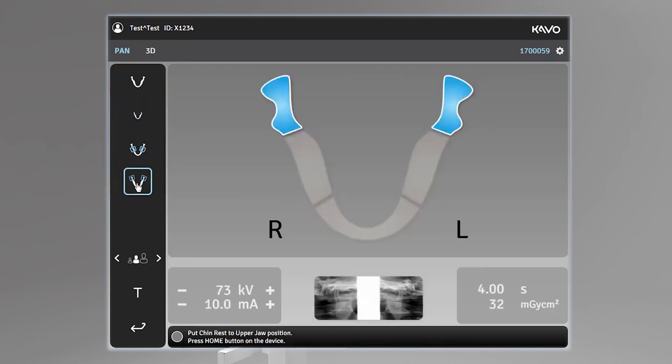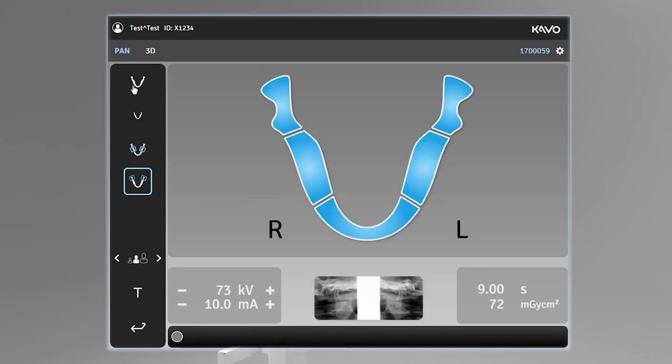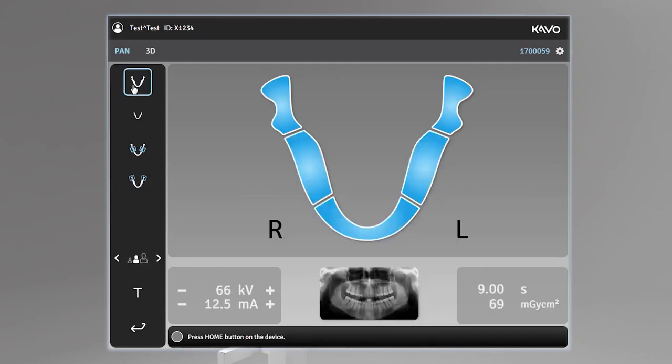The standard panoramic imaging program provides a general view of dental and facial anatomy, typically seen for adolescents and adults.